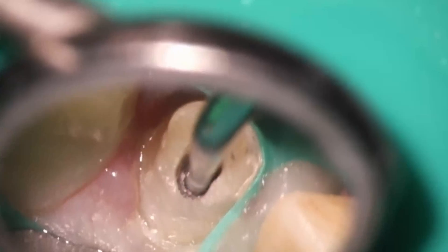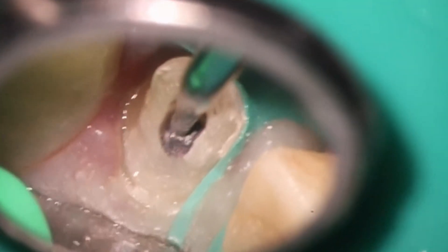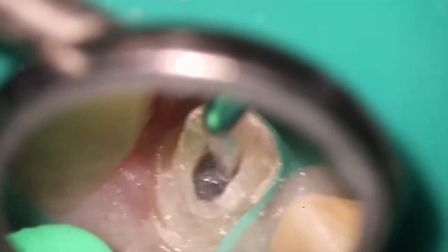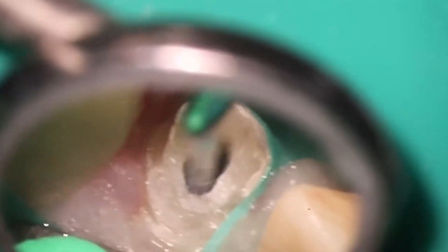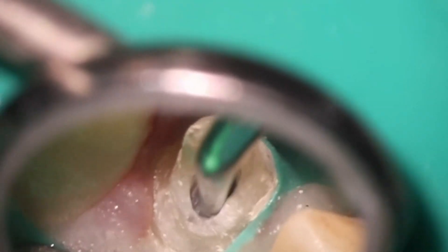So now we've got three things to remove from this tooth. At this point, trying to loosen it back up because now that there's a piece of F1 inside there as well, it's locked in place. Loosening it up — you can see I'm starting to get the movement again, so I'm not worried. I'm also not worried about the F1; it's pretty much encapsulated in gutta percha. Once we get that out, it'll be fine. However, at this point I realize I need to make a slightly larger access, so widening it out here with a workhorse burr.